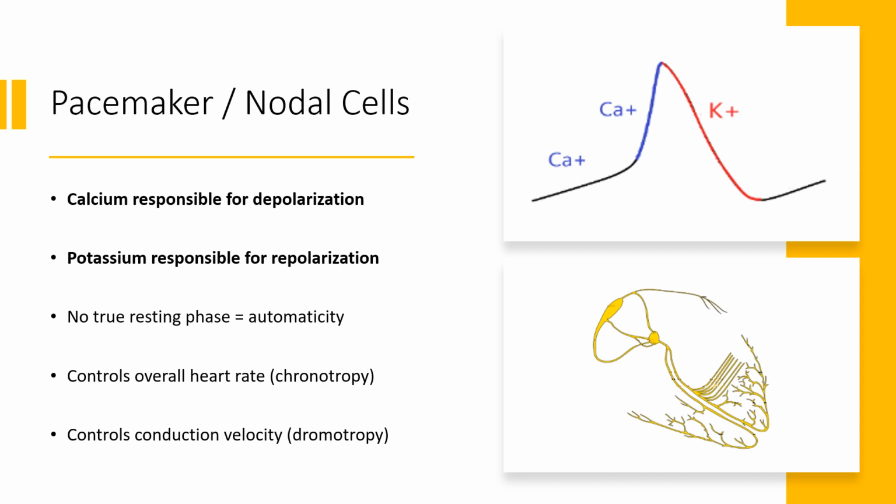So it goes without saying that calcium is a prevalent electrolyte in all the different phases. And so on top of having ST changes with calcium, you can also start to get automaticity changes and heart rate changes associated with significant derangements in your serum calcium levels.